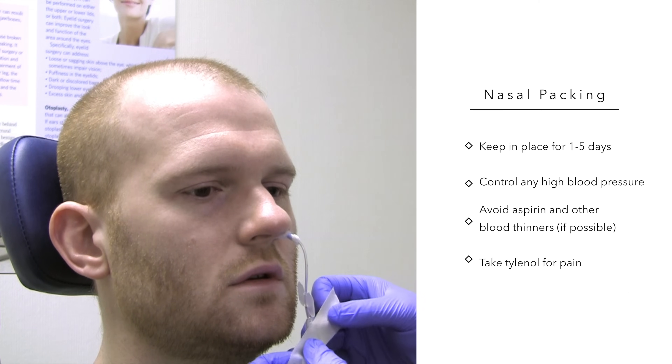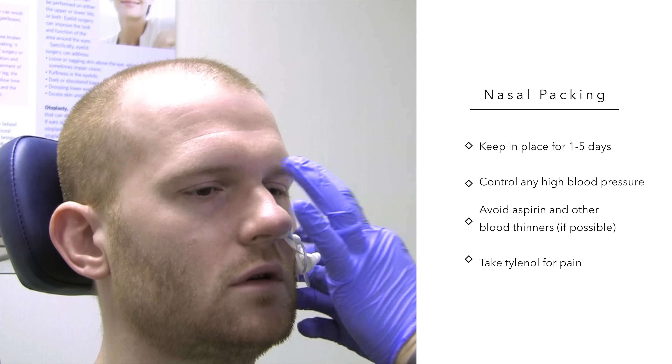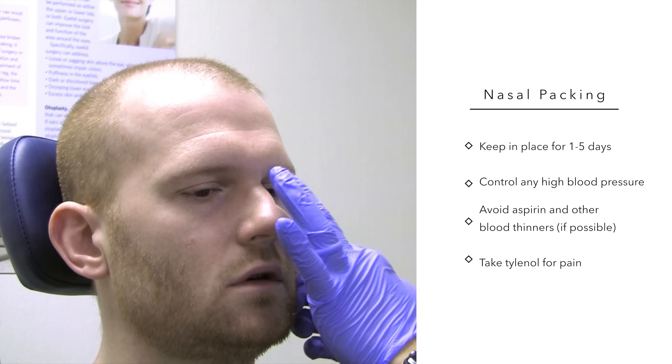The nasal packing tube is then taped to the cheek to keep it out of the way. Depending on the situation, the nasal pack is kept in place for 1 to as long as 5 days.